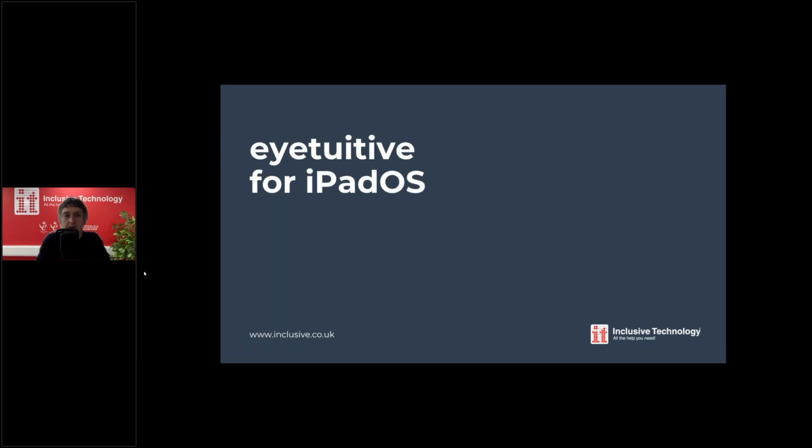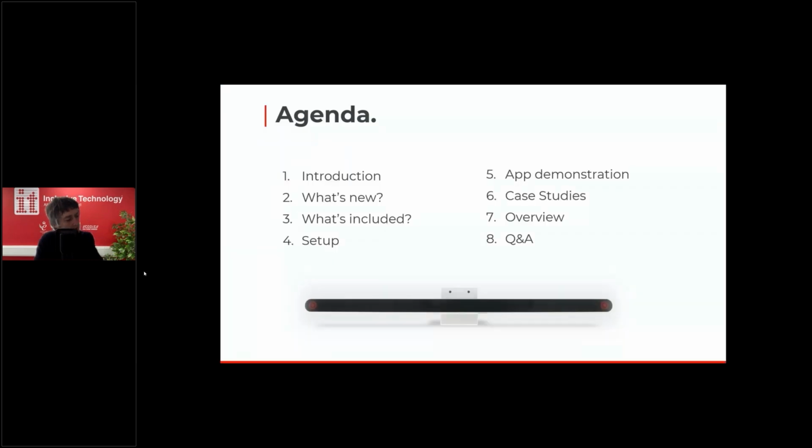Today's webinar is about Eyetuitive for iPadOS. So this is the brand new eye tracker that we're now selling. We've got a lot to get through today. First of all, I'd just like to explain and show you exactly what we're going to be looking at today, give you the agenda.